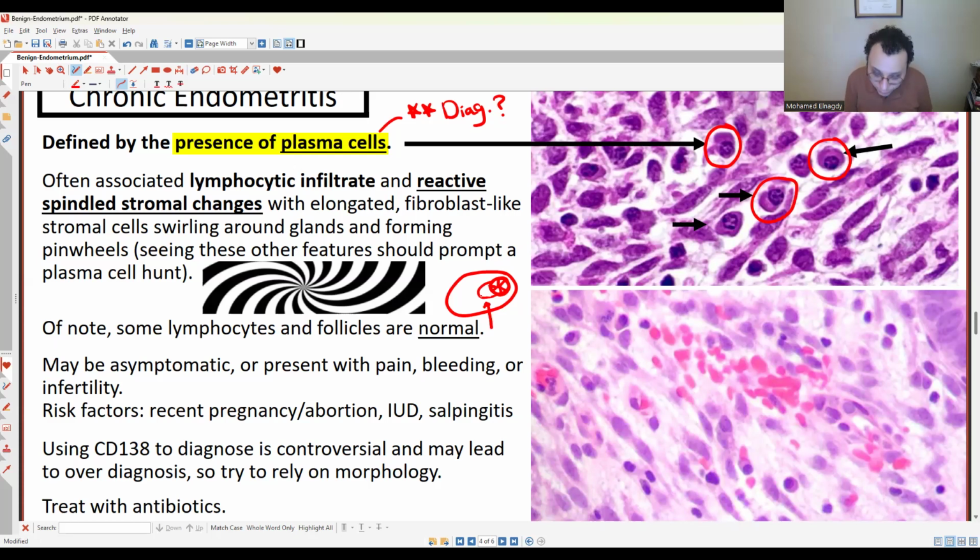That's what we call the perinuclear hof, or sometimes they call it perinuclear halo, but they hate this in hempath. A hematopathologist would hate you to call this perinuclear halo. It's not a halo. I don't know why they get really nervous. It looks like a halo, man, but it's a hof. So make sure you don't say perinuclear halo there, otherwise they get nervous. And they might ask you what this perinuclear hof actually is.